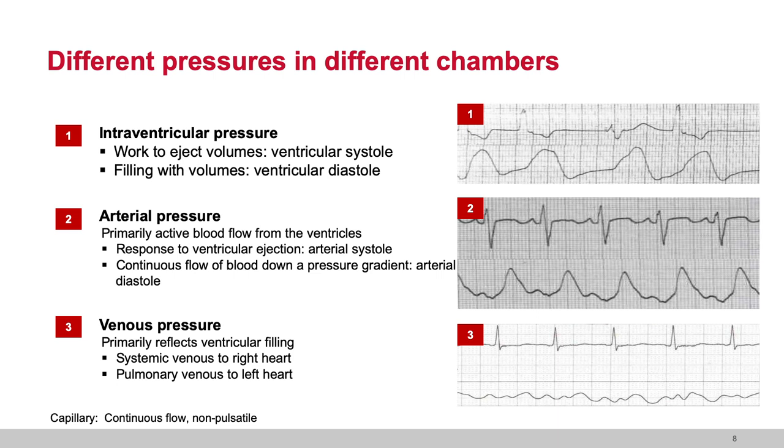Now, the only way we see intraventricular pressures, and there really are a couple: first of all, you only see left ventricular pressure in the cath lab. You can see right ventricular pressure while floating a PA catheter, but you may also monitor right ventricular pressure from the pace port of your pulmonary arterial catheter, if you have that catheter, or from a right ventricular ejection fraction catheter, what we call the REF-OX catheter. So for the majority of people in today's world, we are not monitoring ventricular pressures, but we should.